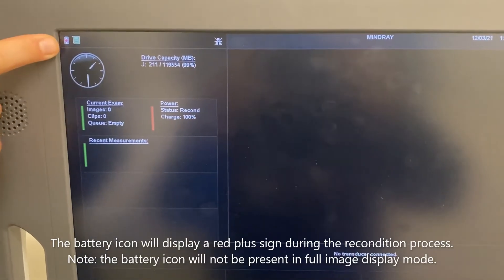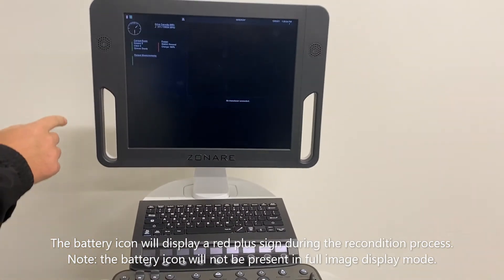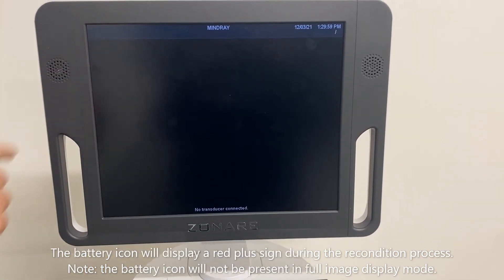The battery icon will display a red plus sign during the reconditioning process. Note: the battery icon will not be present in full image display mode.